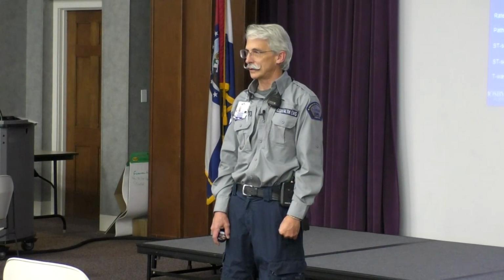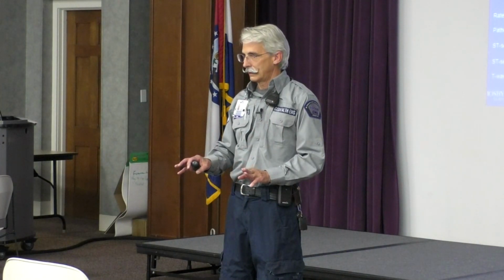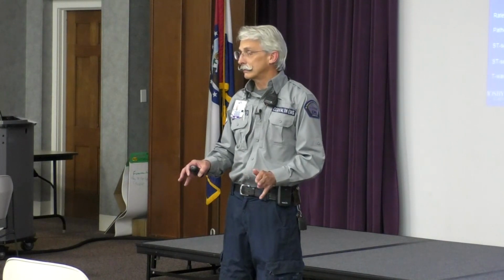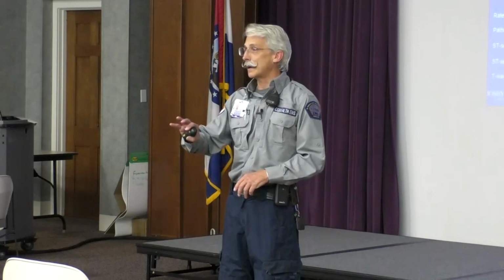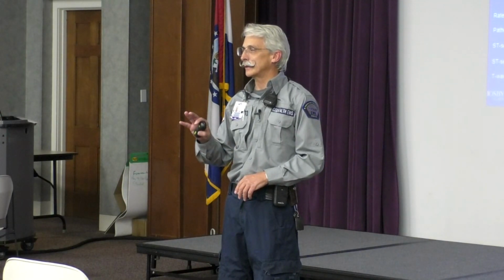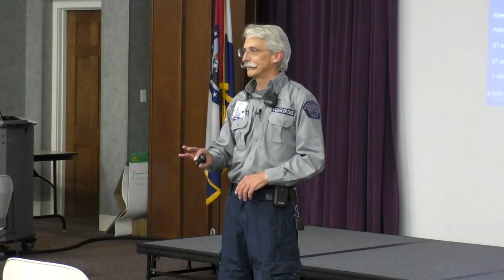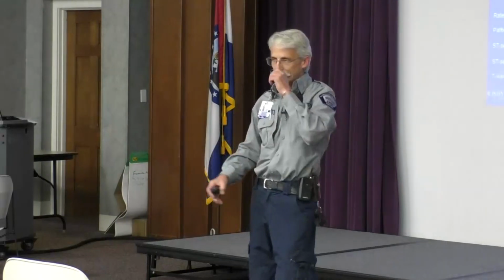You need to do a 12 lead. Right, but wouldn't that give you enough to tell you to go to a 12 lead? You might. I'm okay with you doing a 12 lead based on that, but seeing elevation in lead 2 does not tell me that there's definitely an MI. No, and I'm not saying that. I'm good with that.